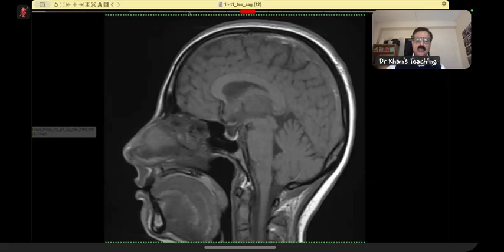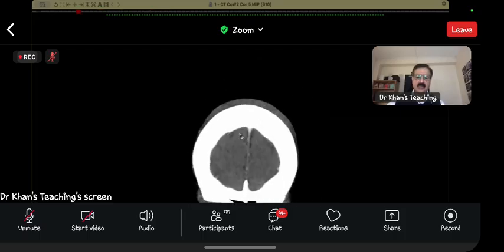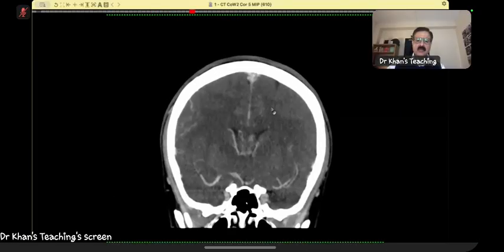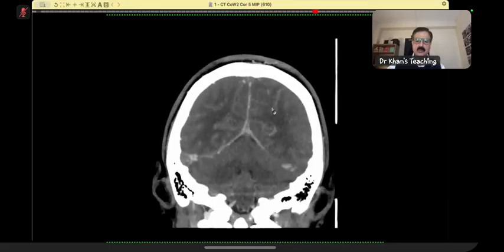Now, what will you do? So, what you will do is that you will ask for a venogram. And if you had picked it up, I would have shown you a venogram. The CT venogram is the investigation of choice, much better than an MR venogram. Having said that, of course, MR venogram is not bad.